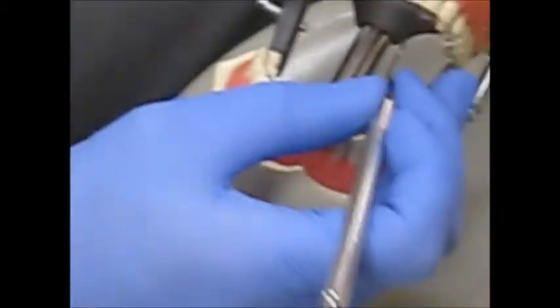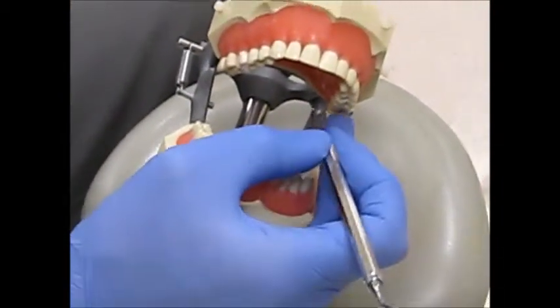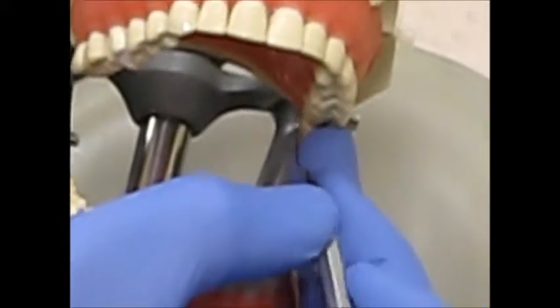To access the maxillary far-left lingual, you can use palm up and be seated at 9 o'clock or towards the front seating zone. Your palm is going to cup under the chin.